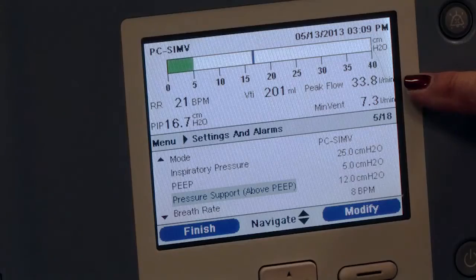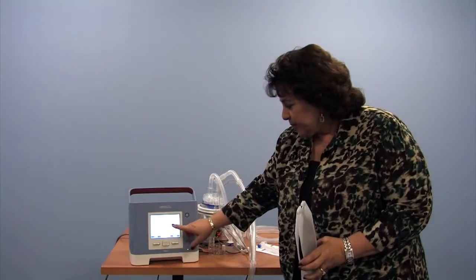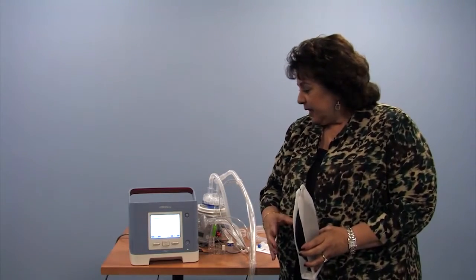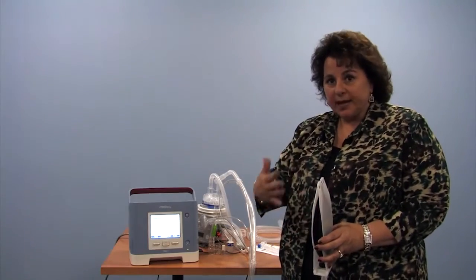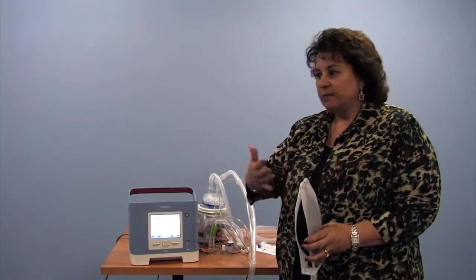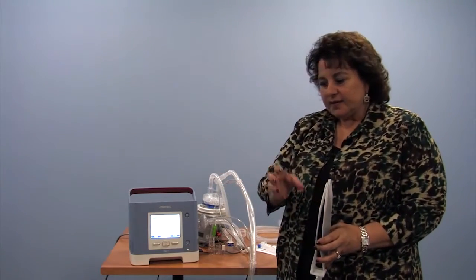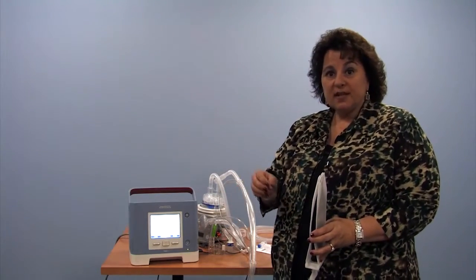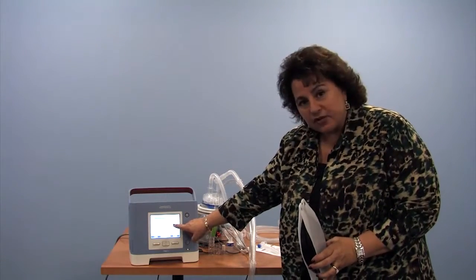The machine is also giving you a peak flow rate here, that it determines on its own, nothing for you to be concerned about. What the machine does, and this is true for all ventilators, is look at the size of the breath and how many breaths you take, and multiply them, and that multiplication goes on over the minute, over the minute, over the minute. The size of the breath times how many breaths equals a term that we call minute ventilation. And here you see minute ventilation, or the abbreviation for it.